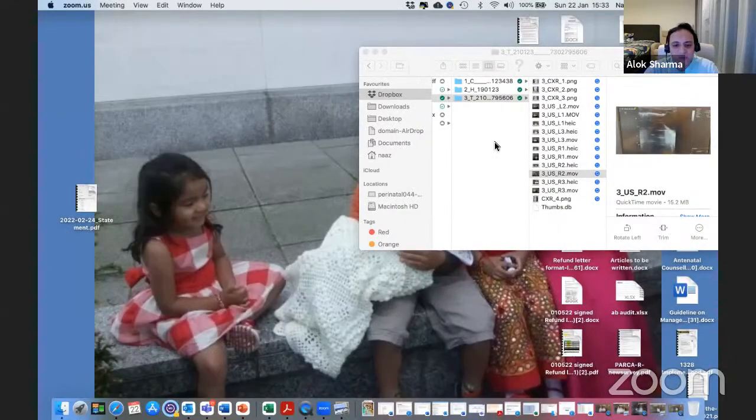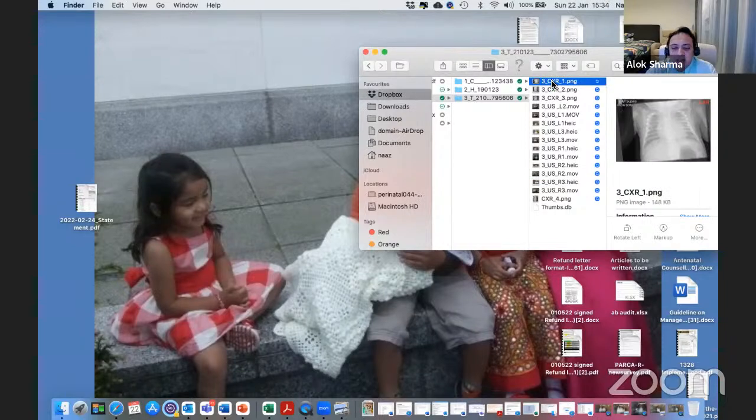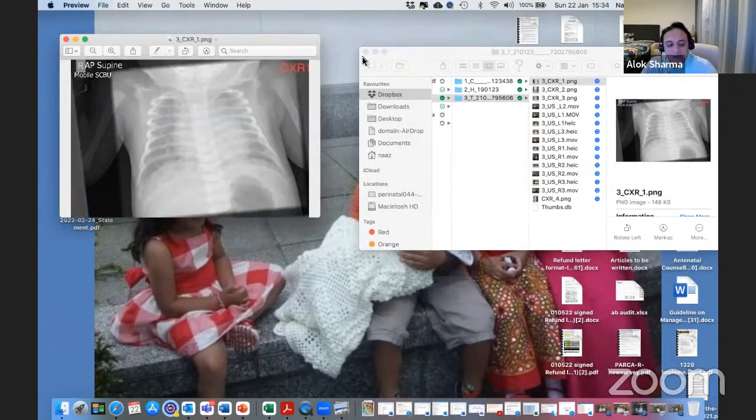I think if you look at the entire ethos of the presentation at this particular point, it's so beautiful to be able to see these images. But what I'm going to emphasize to you is the importance of taking history and clinical correlation. None of the images in that last baby had any evidence of shred sign. Irregular pleura was seen in certain areas, but it was more blurred than irregular, and blurring is a very common sign seen with fluid. If you've got irregular pleura, which is broken with a shred sign, you need to think possibly of an infective cause. You can also see it with BPD.